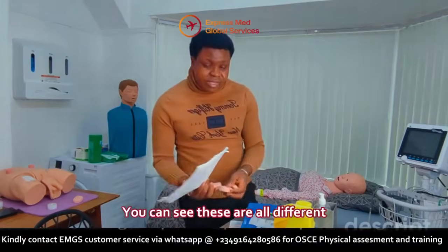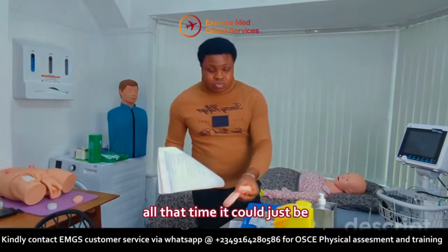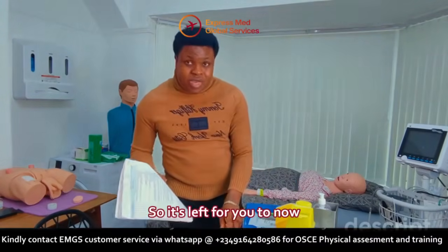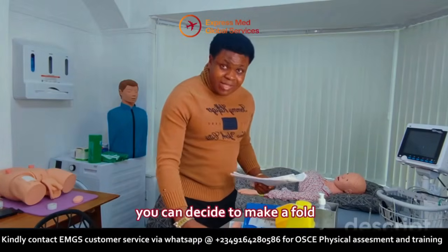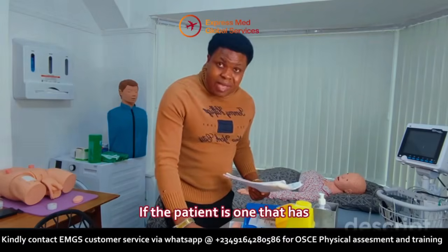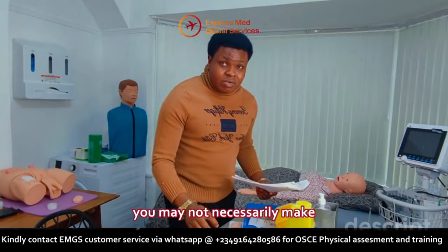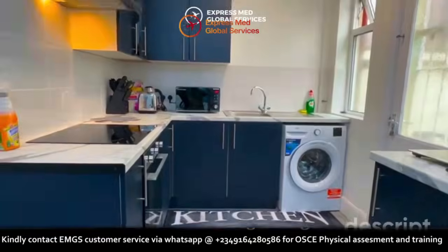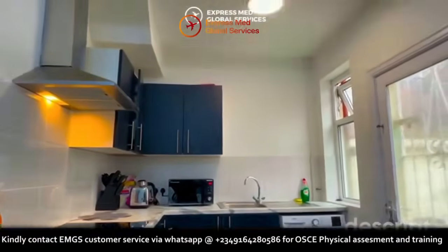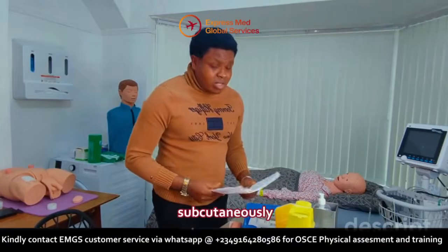I will also show you some other examples of skin. There are different types. These are all skin. You can see these are all different skins. Sometimes the skin can be attached to the arm of the patient. Another time it could just be on the tail. So it's left for you to analyze what you do. And then when you are giving the insulin, you can decide to make a fold of the skin if the patient is one that has a very thin body. Or if not, you will not necessarily make a fold. But it all depends on the size of the patient. But just to say, just make a fold and assume that the patient has got a thin skin, and then you go ahead and administer subcutaneously.